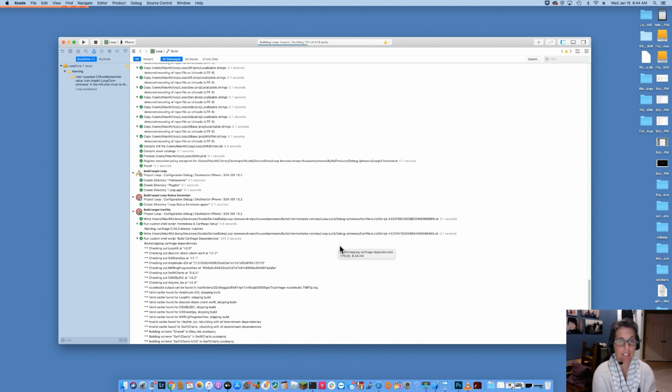Yay, it built. It is building successfully. It made it past that error. It looks like everything's going to install just fine.